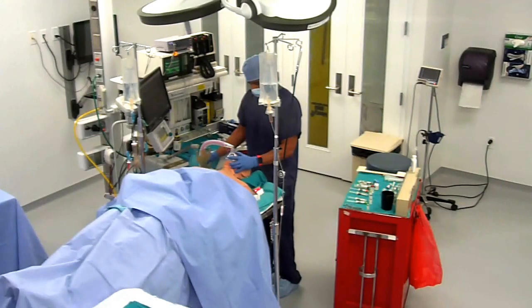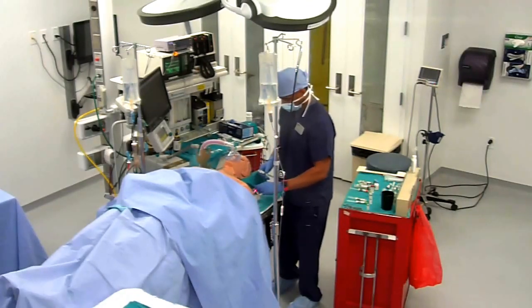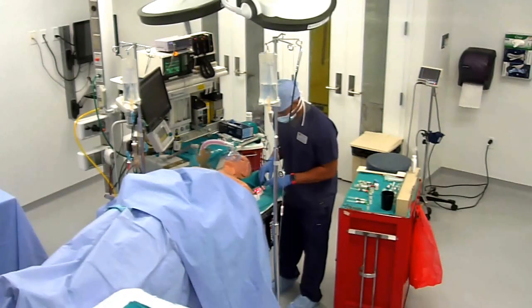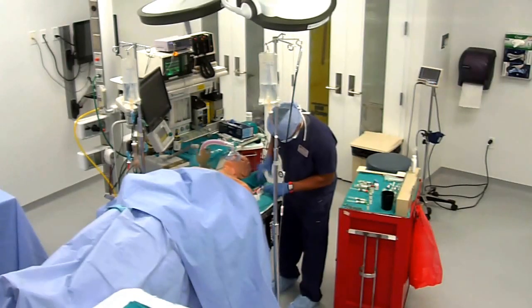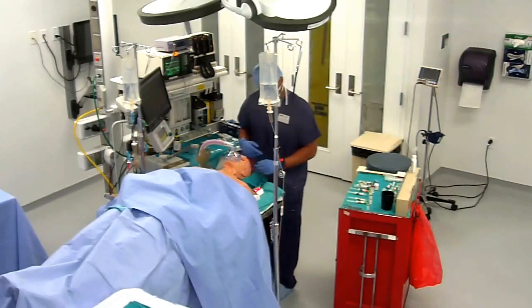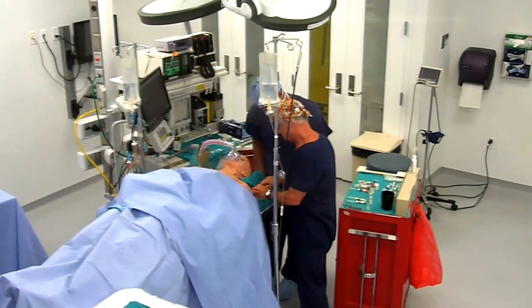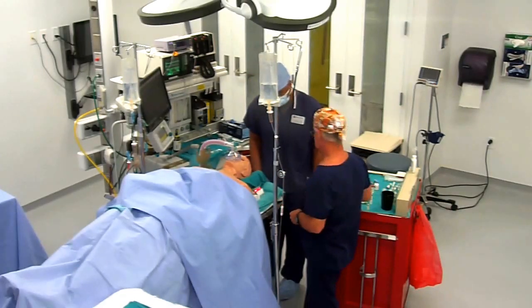The stopcock was closed. Oh, sorry. Rocuronium, 10 milligrams, 1 mil infusing. Why don't you give just a teeny bit of it? Just a small amount. Okay, just give a little bit. Half cc. Half cc. And you stop. Still says it was closed. Sorry. Is it right? Still saying closed. So it must be, I don't know.